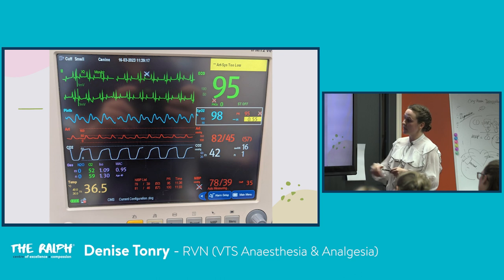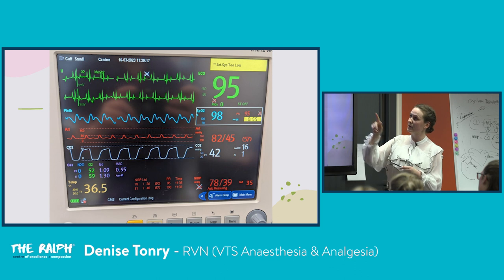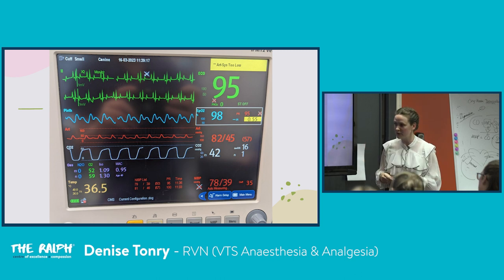And you can see sometimes the oscillometric actually coincides really well with the invasive. I tend to have them running both, and in certain patients it coincides really well. In other patients less so, in arrhythmias less so. But you get this perfect 10 to 30 kilo patient where the oscillometric reads very close to most of my invasive blood pressures. So I'm quite impressed with the oscillometric on these monitors in certain cases. Because the more we read, the more the books say, nah, you can't really trust it, but you do. And you're like, okay. So it's a bit unsettling.